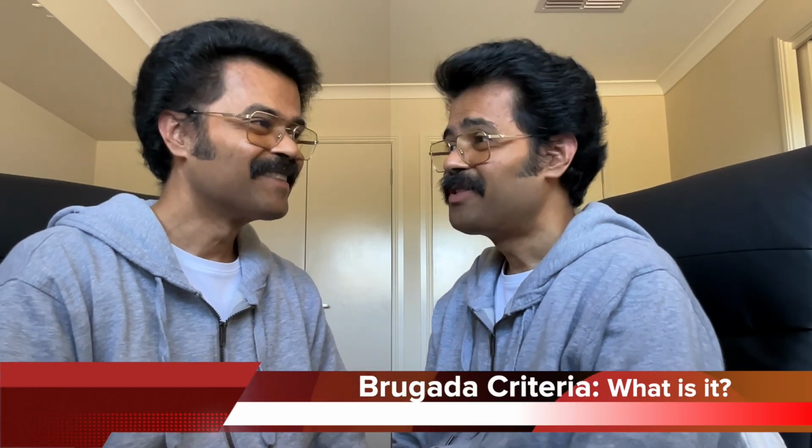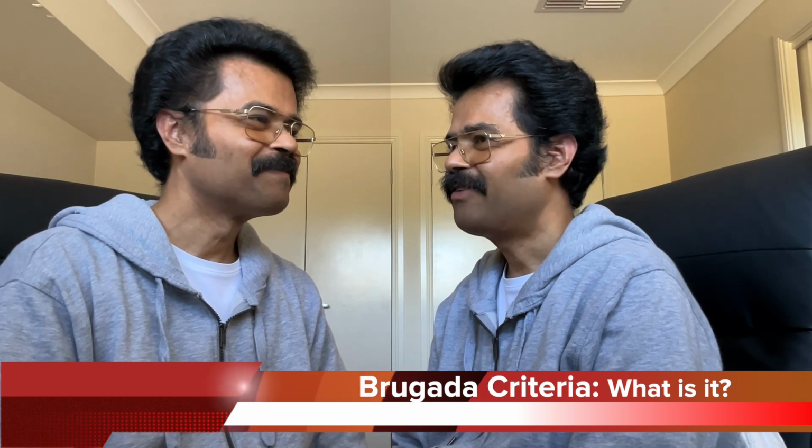Alright, so let's talk about the Brugada criteria that you have mentioned earlier. Tell us, what is the Brugada criteria and how do you use it in your clinical practice? Yeah, so the Brugada criteria is one of those ECG features of VT. And I use this all the time for differentiating VT from SVT if I see a broad complex tachycardia.